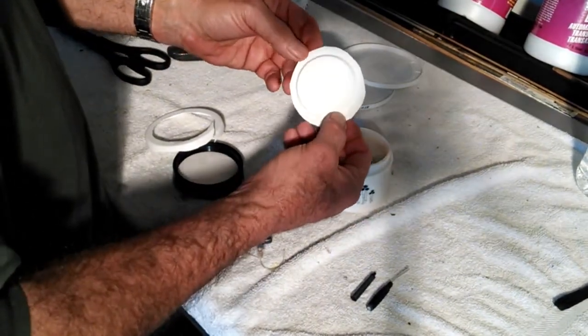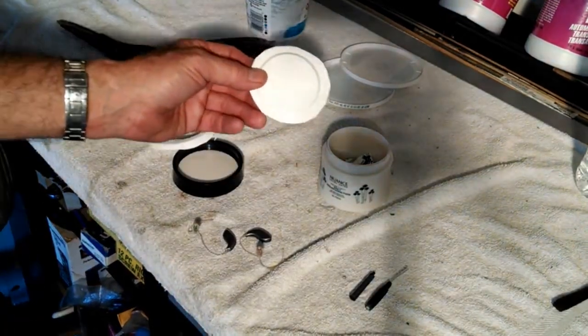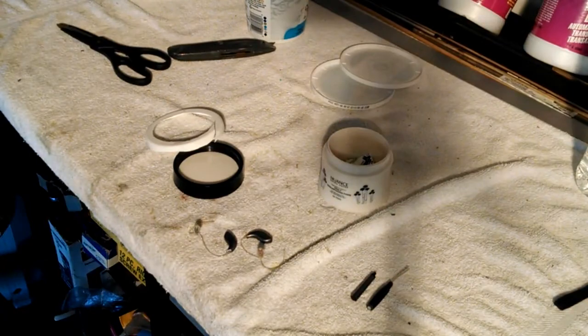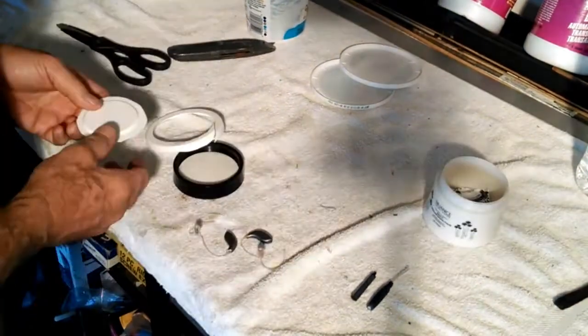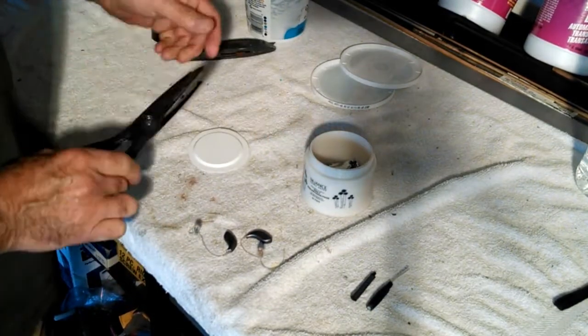See, that doesn't fit — and this is a little sticky, so I'm going to wash it and dry it out before I go any further. Okay, I'm back. That's a little better. Now I'm going to start trimming it down until it fits in there.